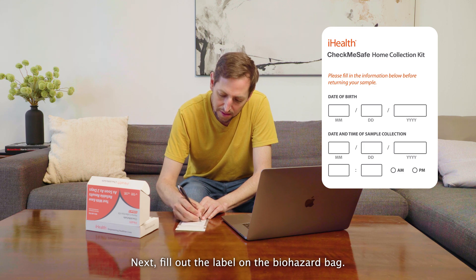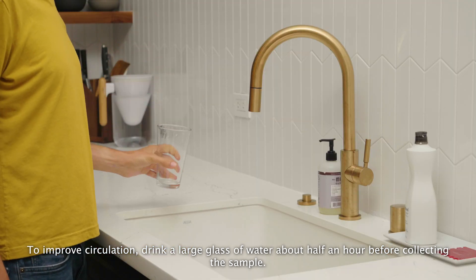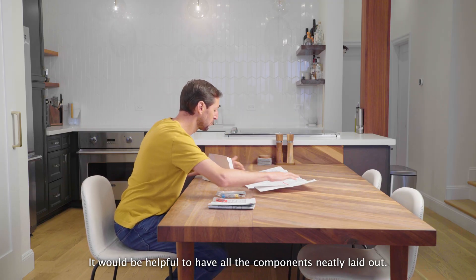Next, fill out the label on the biohazard bag. To improve circulation, drink a large glass of water about half an hour before collecting the sample. Find a table and clean the surface. It would be helpful to have all the components neatly laid out.